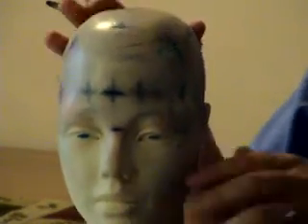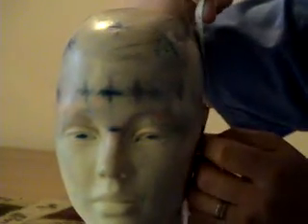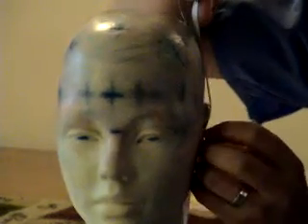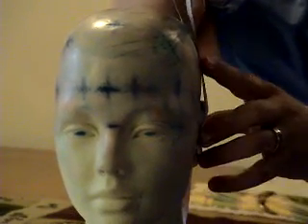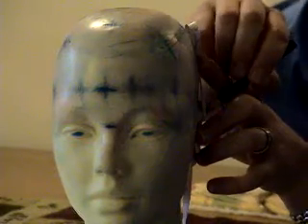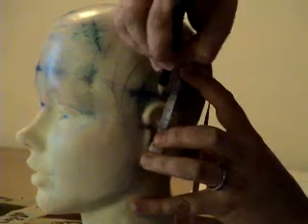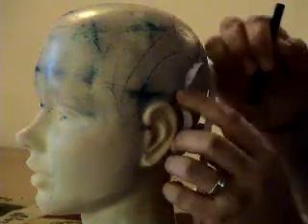After we've made our mark up there, and we've remembered that it is 29 centimeters from preauricular crease to preauricular crease, place our tape again at the crease, and we take 10% of 29, which is 2.9, and we come up and we make a mark. That mark is generally always going to be just above the ear. And we're going to do the same for the other side.